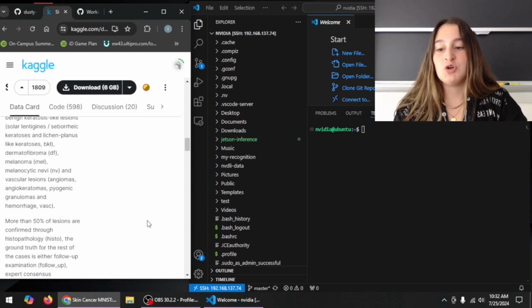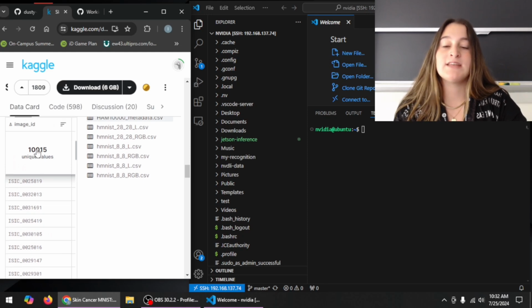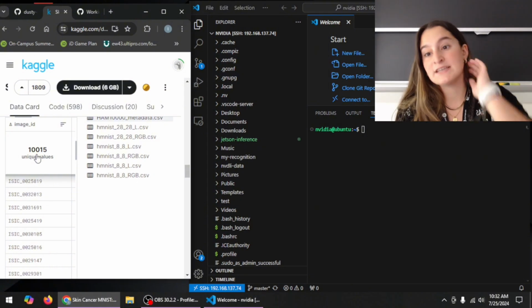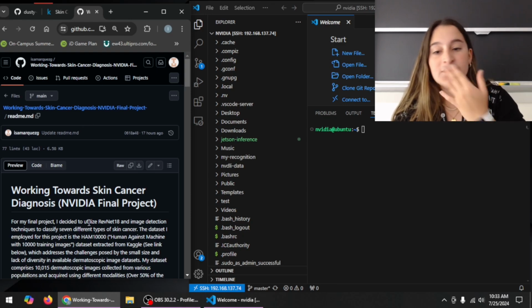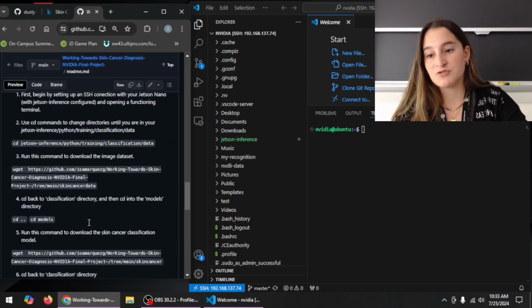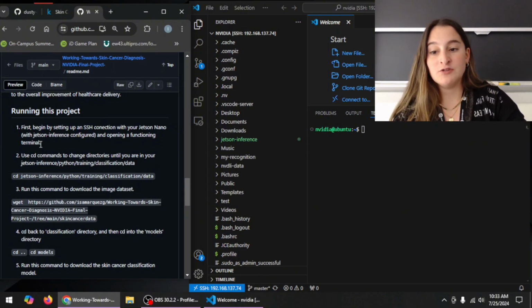I also want to show you this dataset. This is the dataset that I used, as was previously mentioned, and as you can see, it's 10,015 images of skin cancer classes and just different types of it. So I'm going to be linking the GitHub for this project in this video, and in order to do it, you're going to want to scroll down to the running this project section, and here you will get a series of instructions on how to do it.